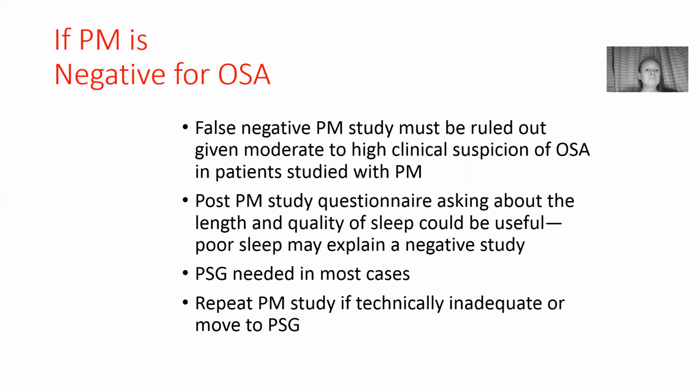After a home sleep study, a questionnaire should be performed, which asks the patient how long they think they slept and how well they think they slept. If the patient states, I don't think I slept very well, or I didn't sleep as long as I normally do, that could be the reason they have a negative study, because the more time they're awake, the fewer events they're going to have.